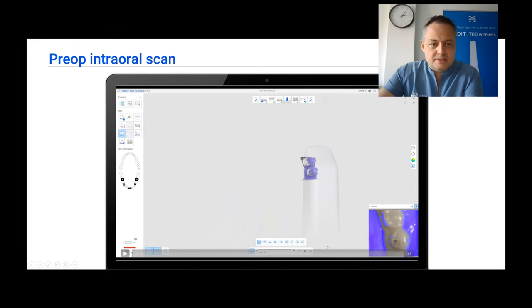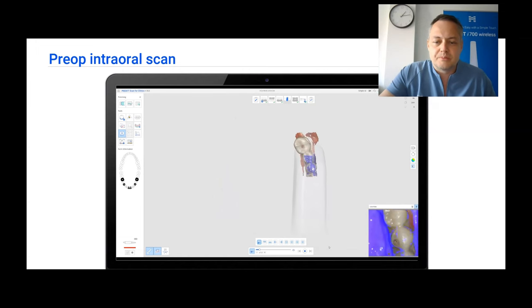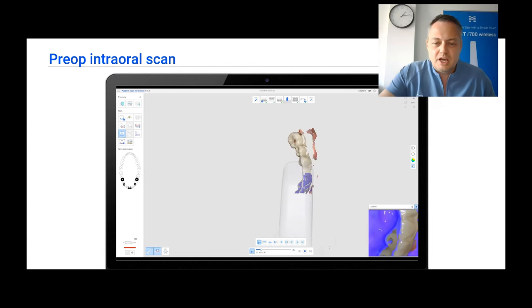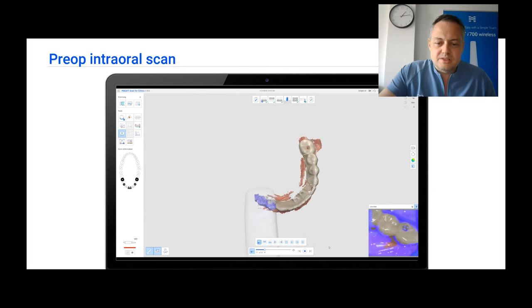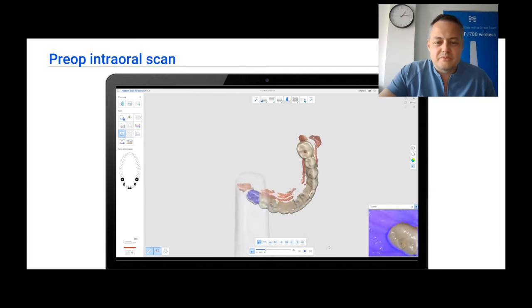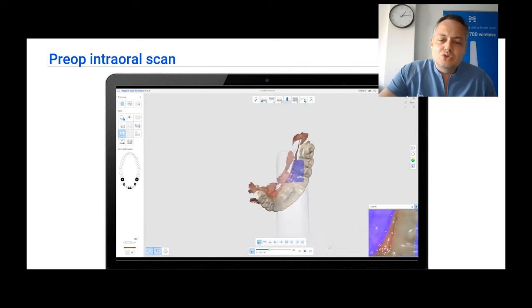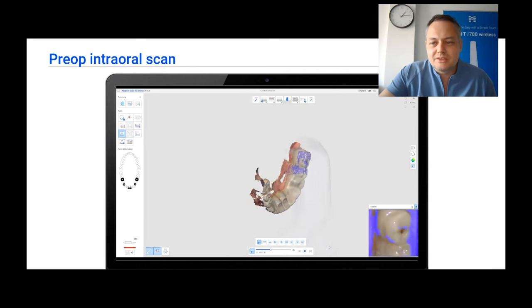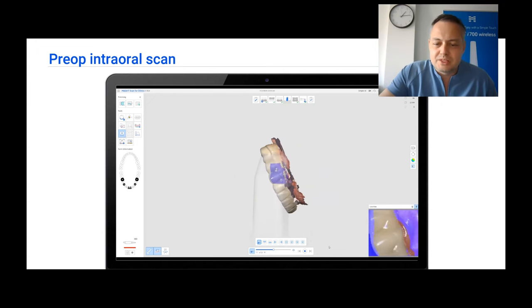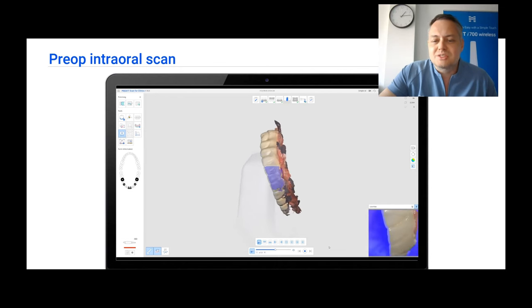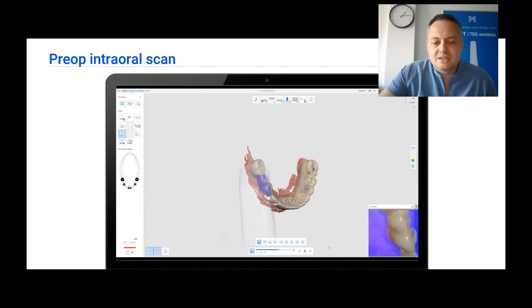In the next step, we are going to scan the pre-op. The pre-op is being composed of the temp prosthesis of this patient. We start from the occlusal surface and we gather a lot of detail. It's very easily scanned — it's a fixed prosthesis, so it has a lot of detail. We will also try to get the fixed gingiva on the labial and also on the lingual side, because this fixed gingiva just beneath the prosthesis is going to help us align the scans altogether.